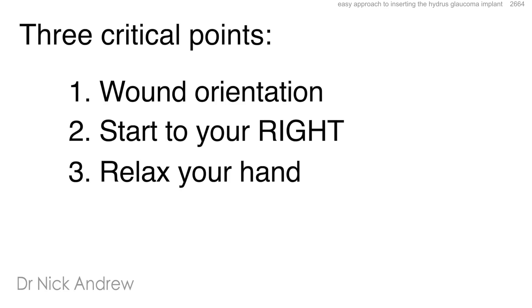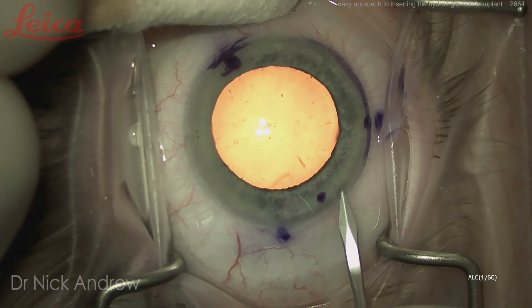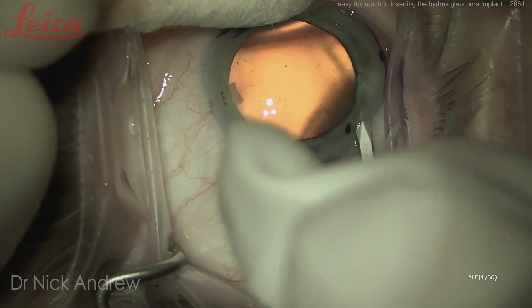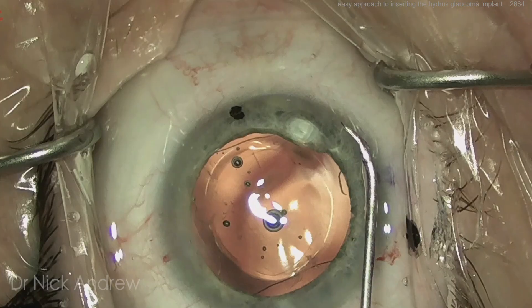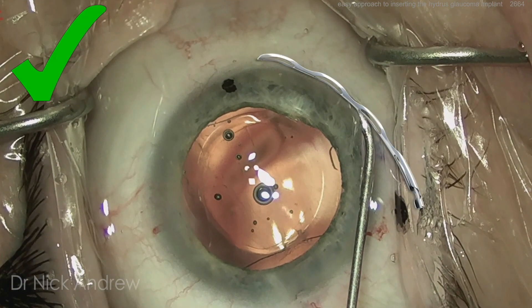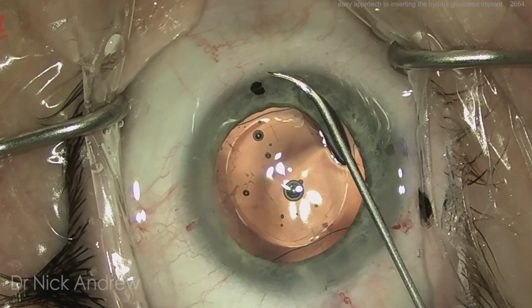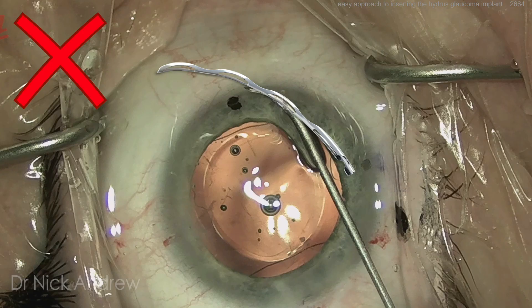There are three main points: wound orientation, starting as far to your right as possible, and relaxing your hand. For a right-handed surgeon, you want your Hydrus incision pointing towards the limbus on your right, and the incision just wider than one millimeter. This allows a perfectly flat angle of attack so that as the Hydrus is delivered, it will naturally follow the contour of the limbus. You don't want to implant the Hydrus directly opposite you, as this results in a steep angle of attack to Schlem's canal.